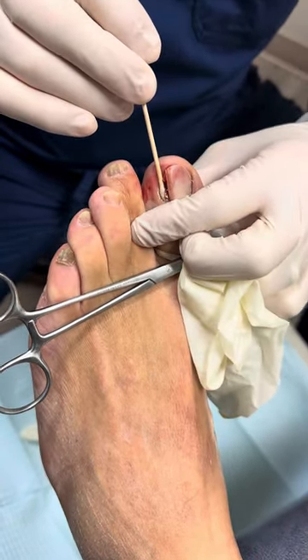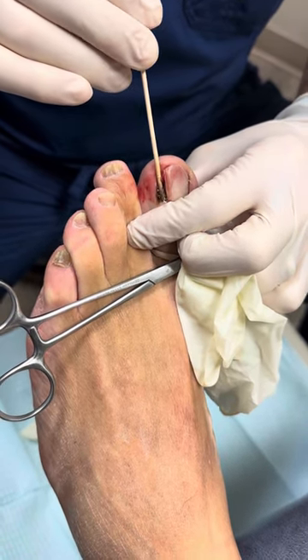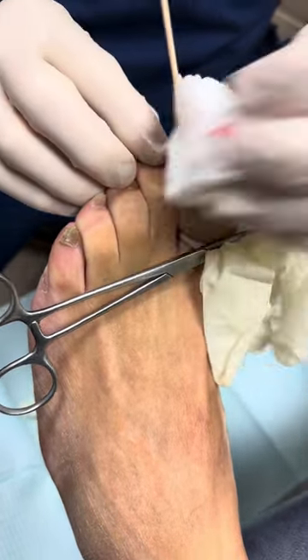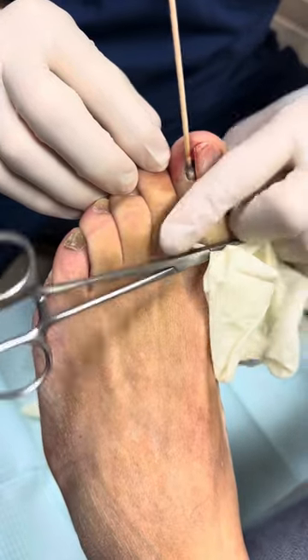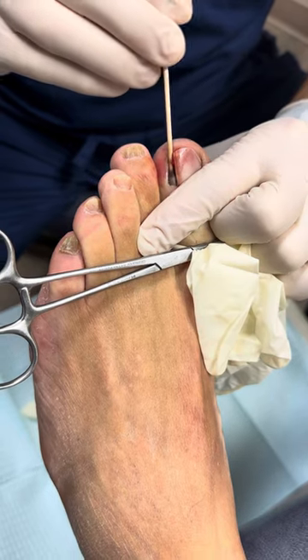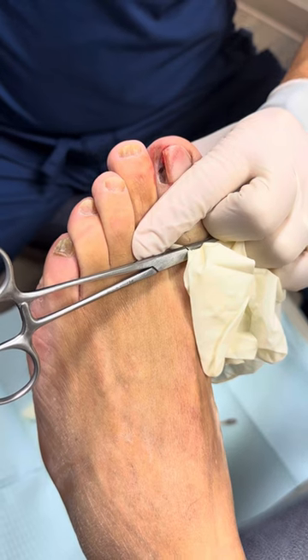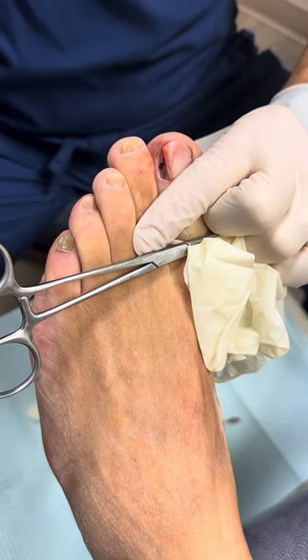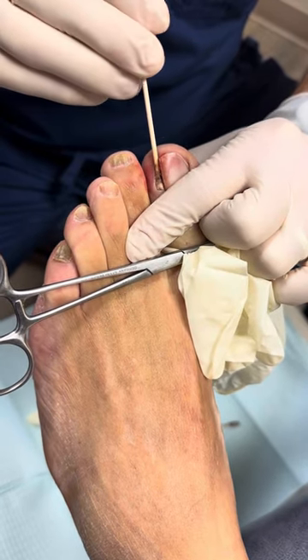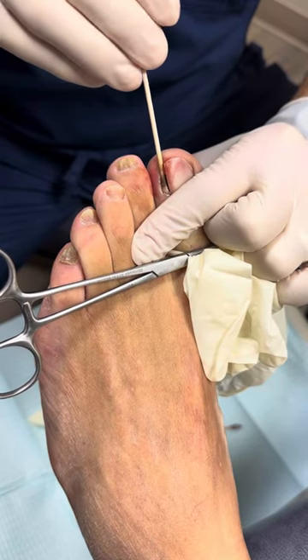We stick that under the nail matrix, against the matrix and against the nail bed. You can see it's turning a little black because as it interacts with the blood, that blood is coagulating. We're trying to keep this stuff off the skin because it's a chemical and it creates a chemical burn. As we do that, the bleeding will really stop because there's also a cauterization effect. We're going to do that four separate times, just twisting it back and forth.